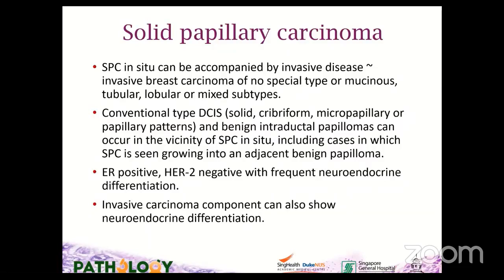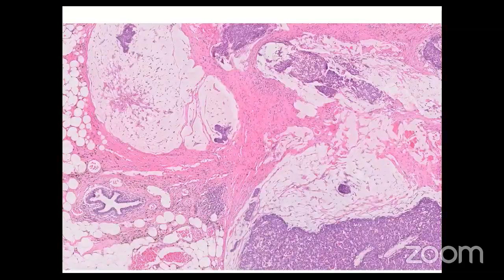Solid papillary carcinomas are usually ER positive, HER2 negative, with frequent neuroendocrine differentiation as observed earlier. The invasive carcinoma component can also demonstrate neuroendocrine differentiation.